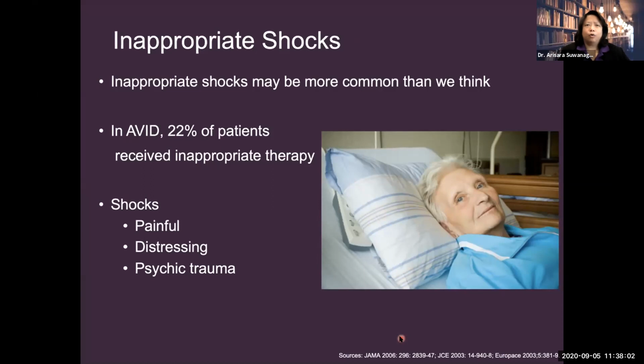Don't ask me how bad it is, because I never had a shock before. I just give the shock to the patients, right? But they describe it as hard as a horse kick. Of course, I have never been kicked by a horse either, so I don't know, but it's going to be very bad. Usually if it's a true shock, the patients might already be in syncope, so they don't feel it. But if it's an inappropriate shock and the patient is in SVT, they won't like it when they feel they were shocked or punched in their chest.